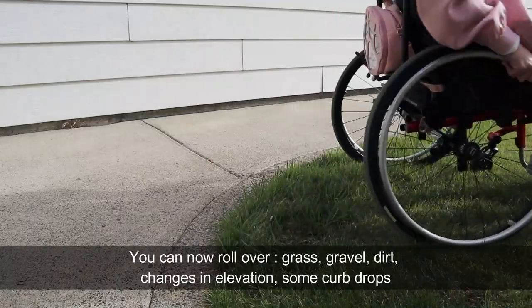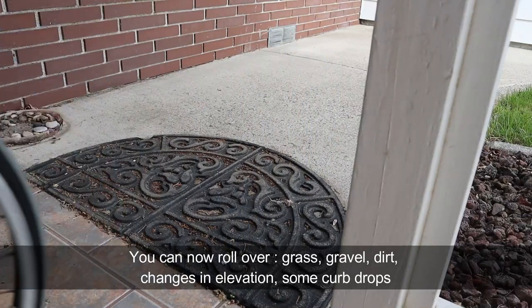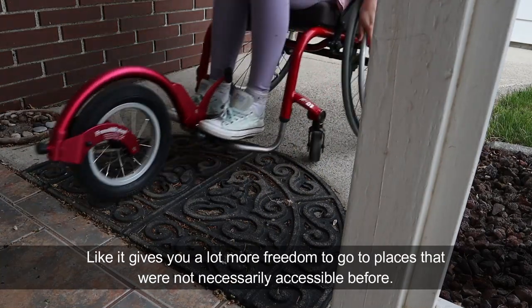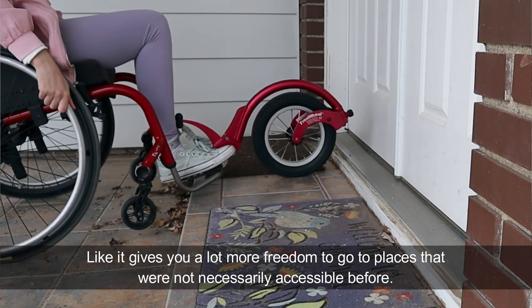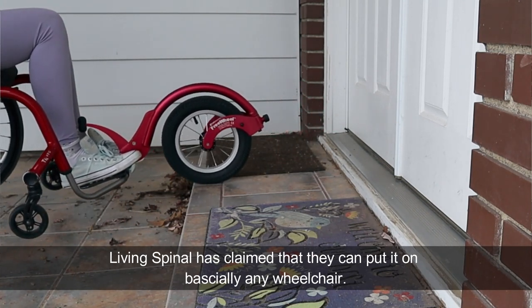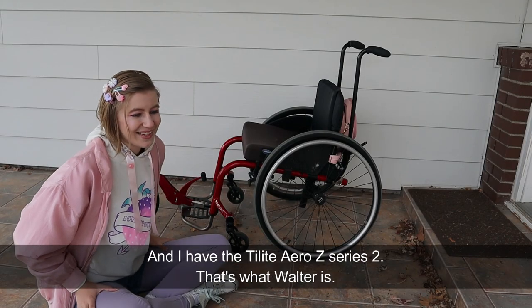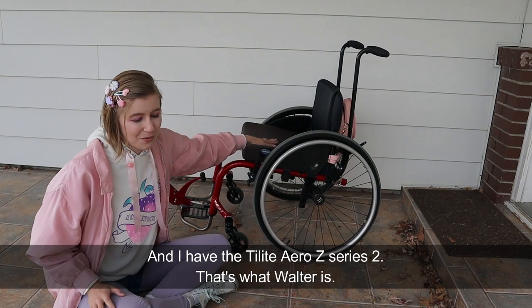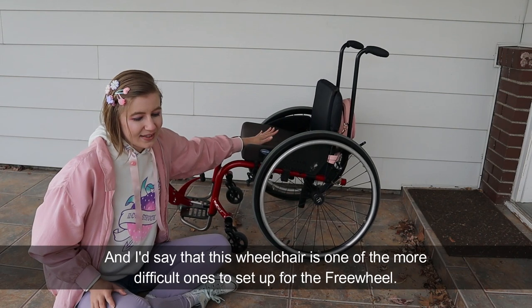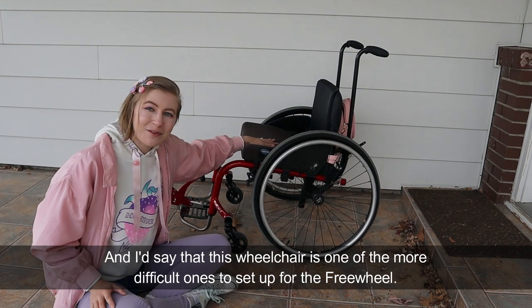You can now roll over grass, gravel, dirt, changes in elevation, some curb drops. It gives you a lot more freedom to go to places that were not necessarily accessible before. Living Spinal has claimed that they can put it on basically any wheelchair. I have the TiLite Aero Z series 2 — that's what Walter is — and I'd say that this wheelchair is one of the more difficult ones to set up for the freewheel.